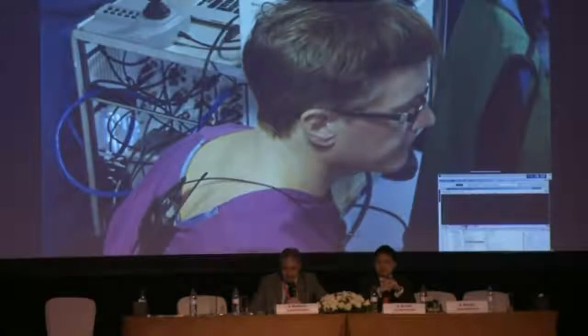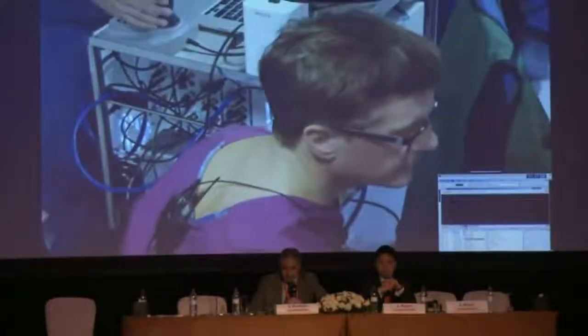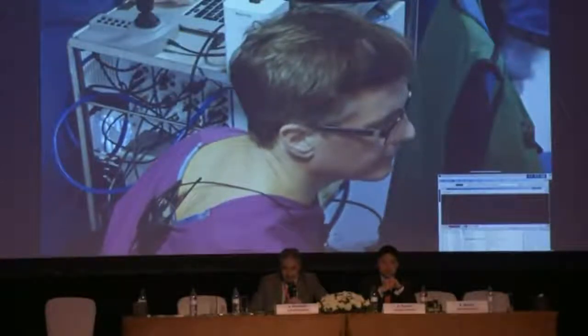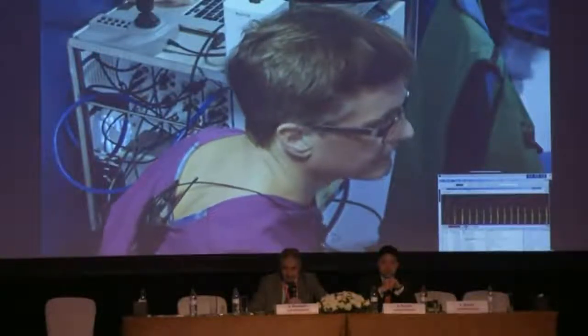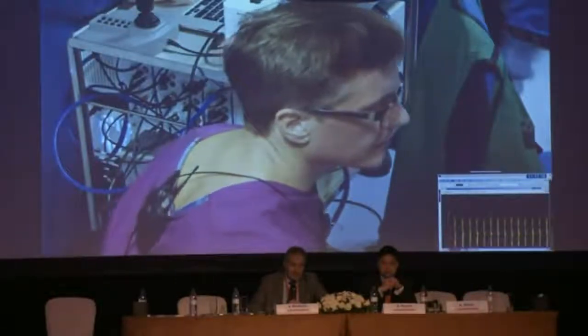See if I can find a bit where you... I don't know whether you can see the signals on the board, can you? Let me see if I can find a bit where we've got some mapping of the atrium. So here... can we have the signals enlarged, please? So have that on the big screen.